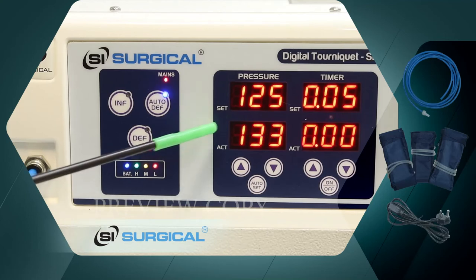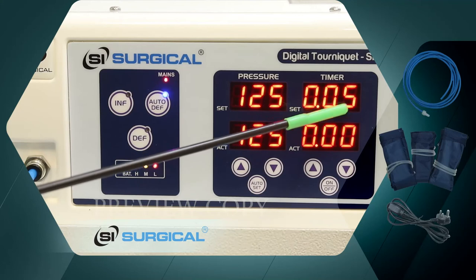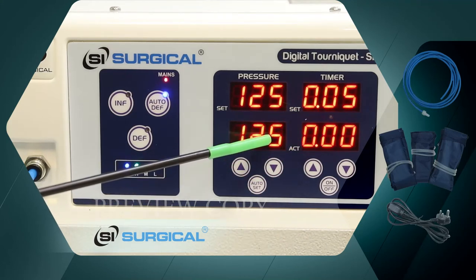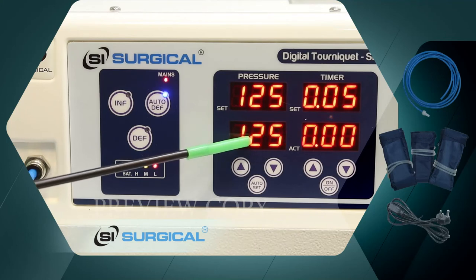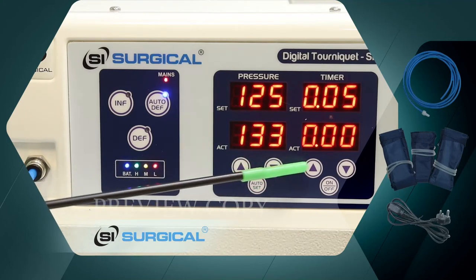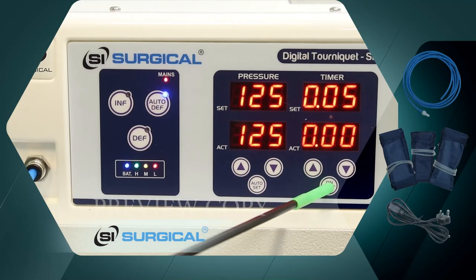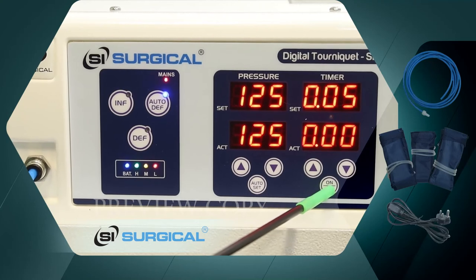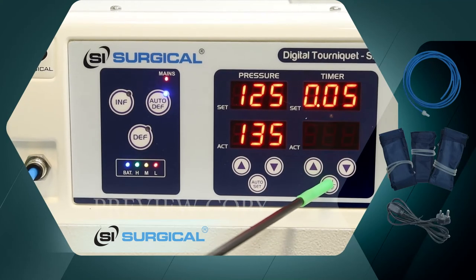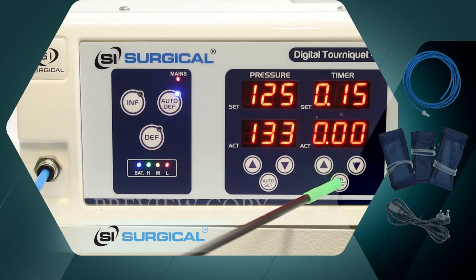This will automatically deflate when the time is completed. After 3 minutes, it will show an alert. We can increase the time to 15 minutes by pressing the on-off button and increasing the time. The time is now set to 15 minutes.